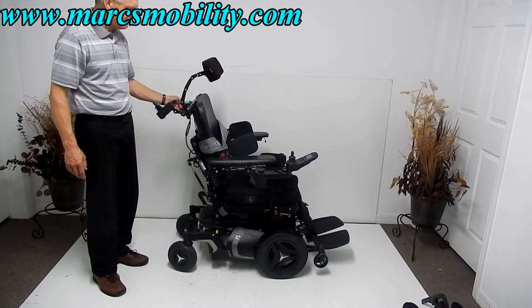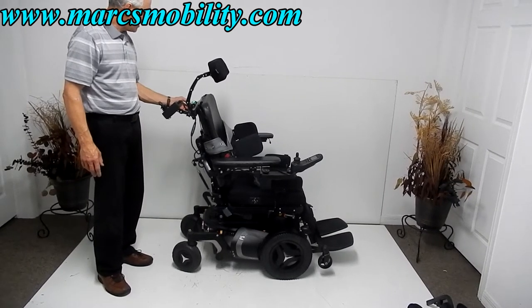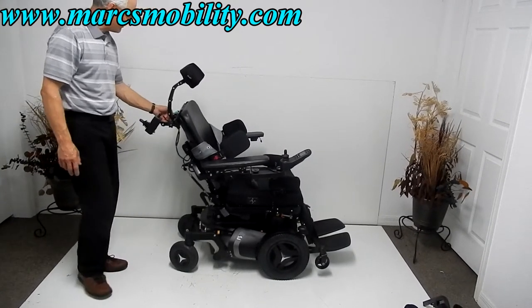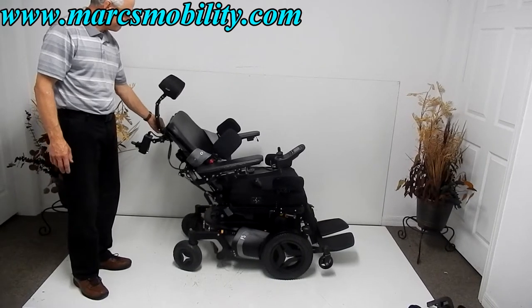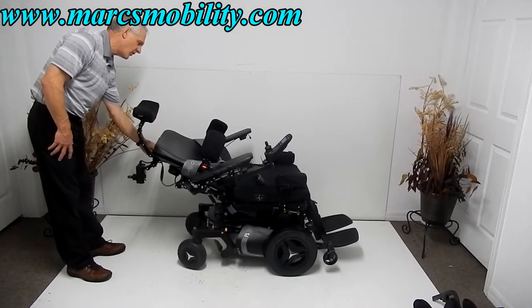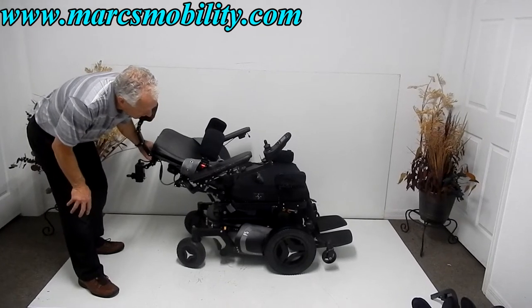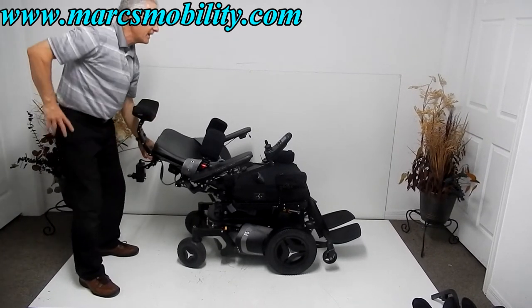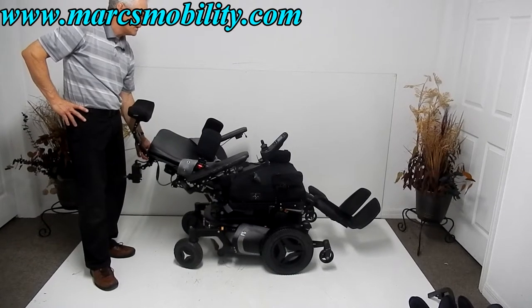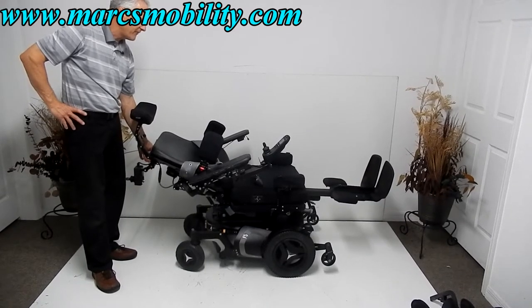Next is the electric recline. This is a good recline, though not a full flat recline. The chair also has electric leg rests up front. You can be fully reclined with your legs elevated. The legs are adjustable in length depending on your height and build, so you can have your legs higher than your body if you want.